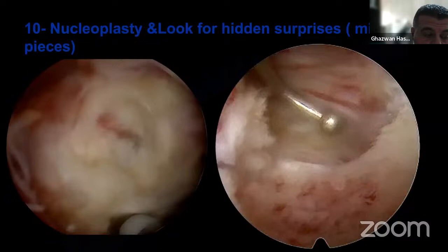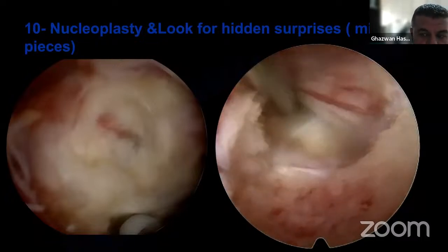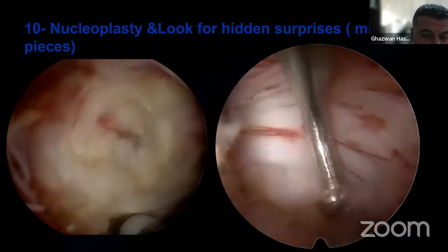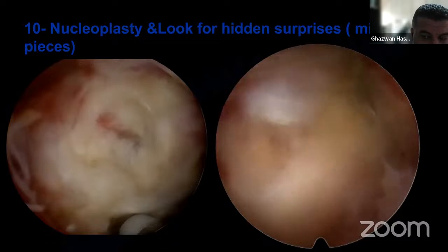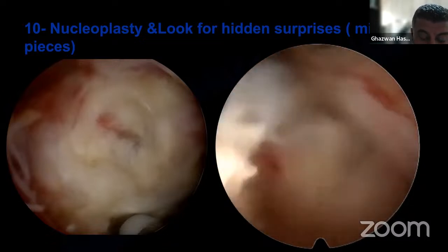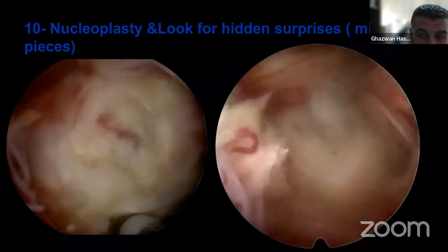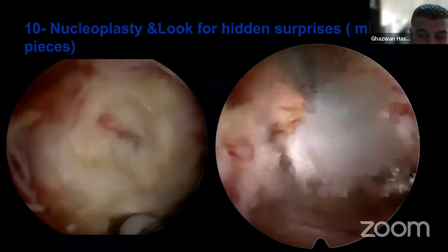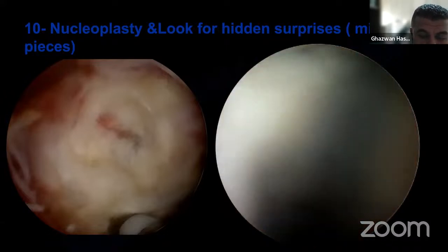And finally, when you remove the disc, try to look for any remnant pieces that could be present, especially when you have a good review of the MRI pre-operatively, so you can find some missed or, let's say, migrated piece, and you can remove it with a hook.